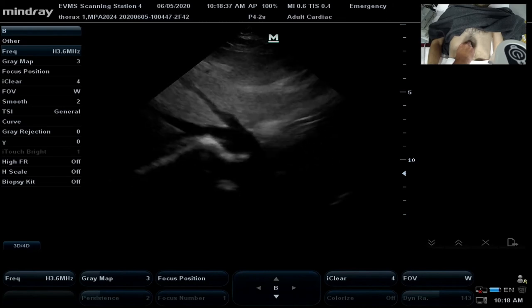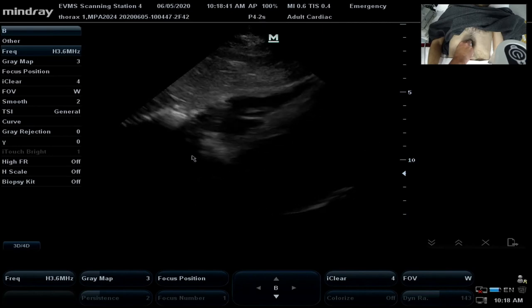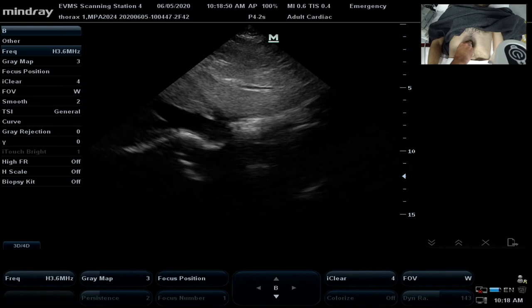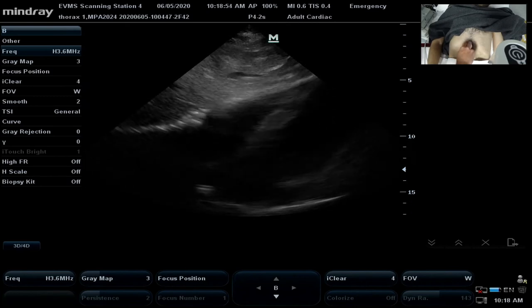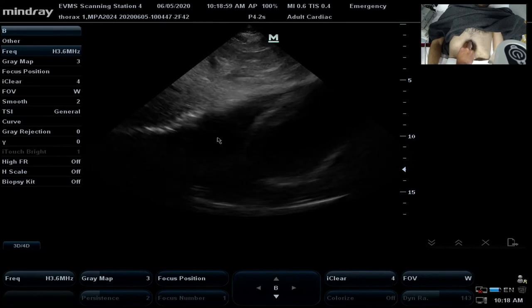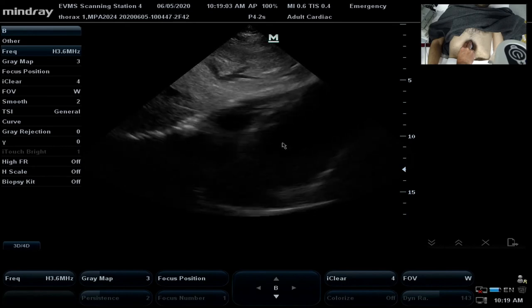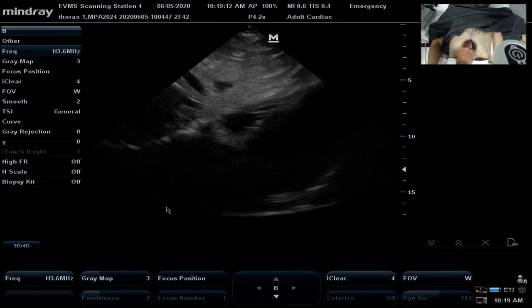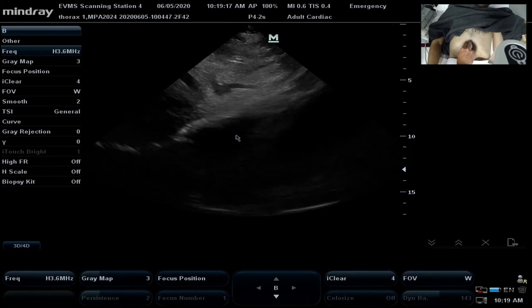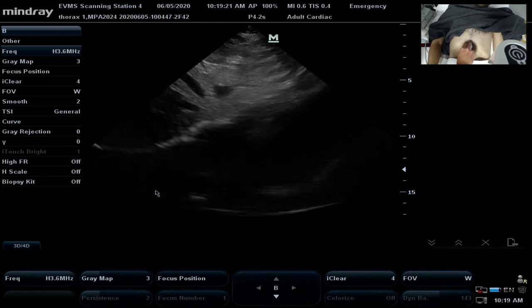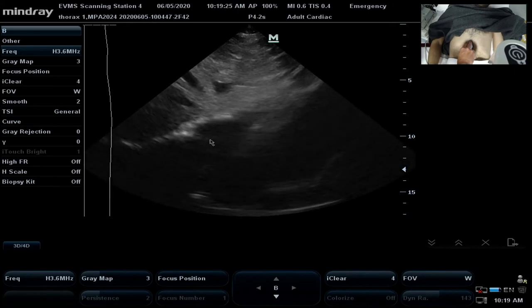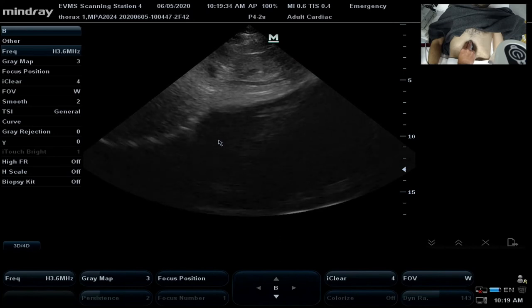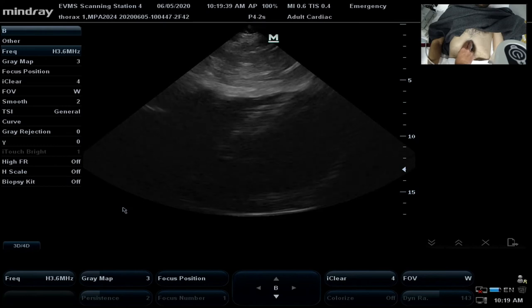If we get our patient to take a breath in, notice how the cardiac window starts to open up. We're going to increase our depth a little. Now we can see all four chambers: right atrium, left atrium, left ventricle, and the right ventricle is right here. We're not seeing the tricuspid valve yet — we're seeing movement of the atrioventricular wall. We can see valve movement as it opens up. This will require a little bit of fine-tuning.